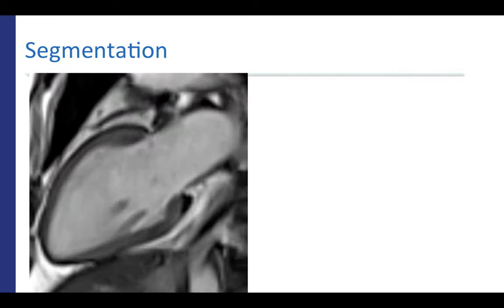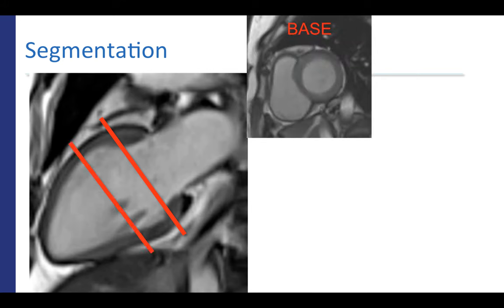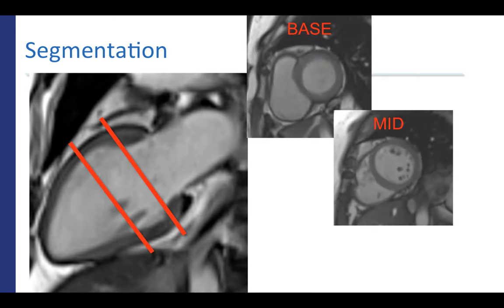This is a representative 2-chamber cardiac MRI SSFP image, which will be used to show the relative locations of representative short axis slices. Starting with a basal short axis slice, followed by a midventricular short axis slice. You'll note that the papillary muscles are typically seen on a midventricular short axis slice, in comparison to the basal short axis slice, where you do not typically see papillary muscles.